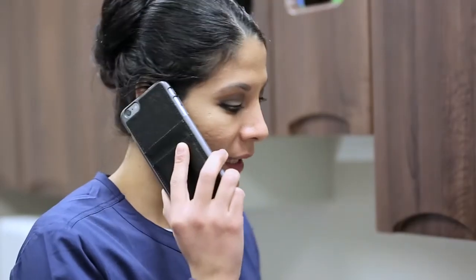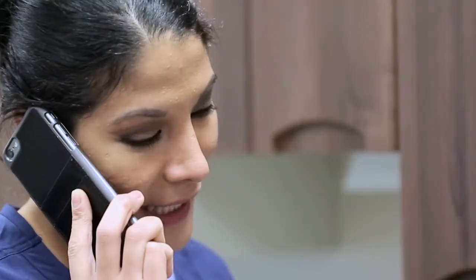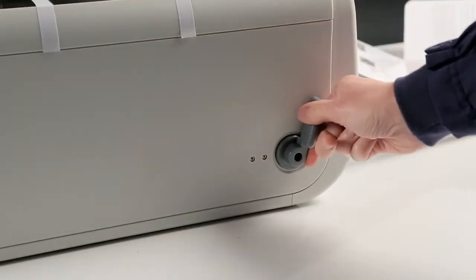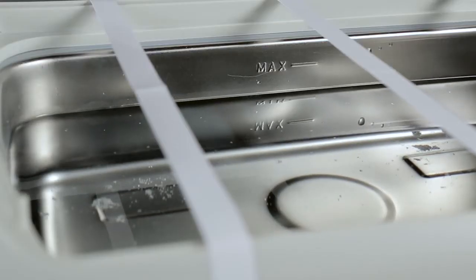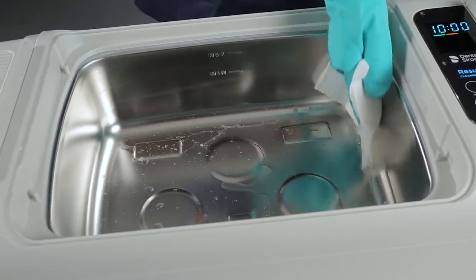If you are uncertain that your cleaner is producing similar results, consider contacting your dental dealer technical support team or retail representative. Before further use, drain and clean your ultrasonic cleaner. Make certain you remove all foil remnants.